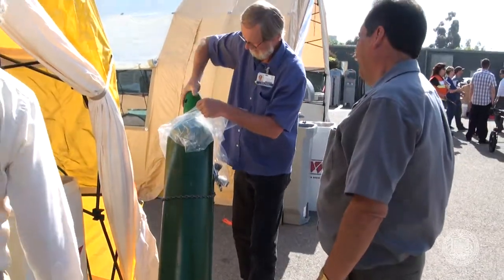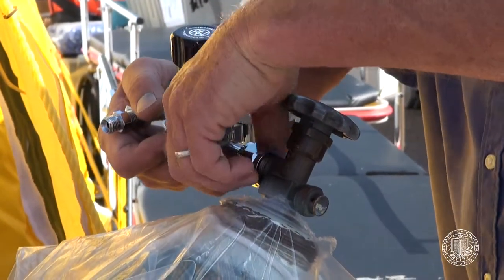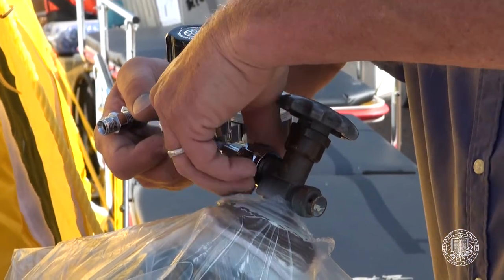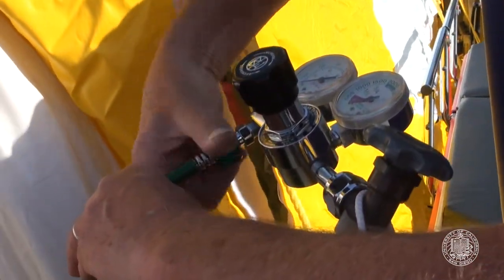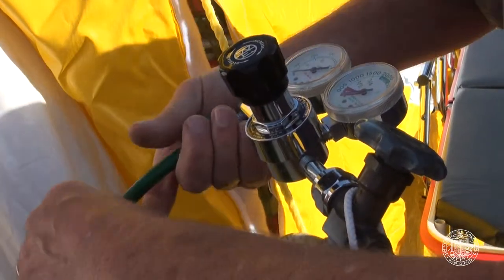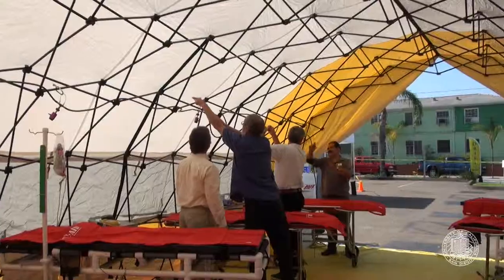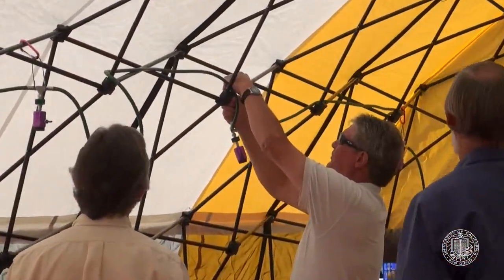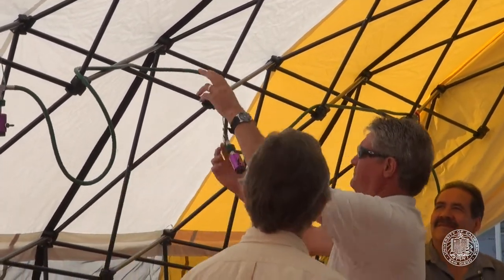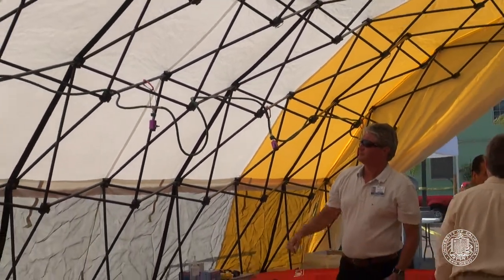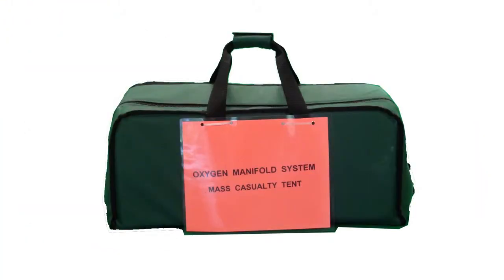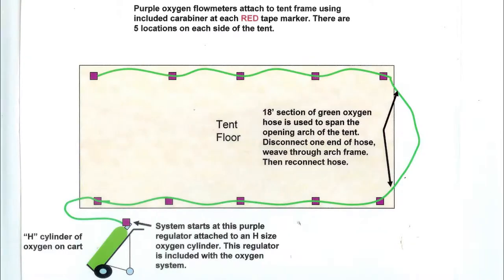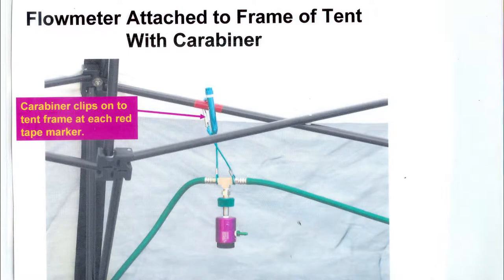The tank has 2,000 pounds of pressure — it's a standard H-cylinder of oxygen. The regulator, either a chrome one or a purple one (both come in the bag), is assembled, the hose is connected, and the system is plumbed to run around the tent. The entire gas system — all flow meters and the regulator — is preassembled and kept in a green duffel bag labeled as such. It contains an instruction sheet with a simple drawing showing how the system is laid out in the tent.